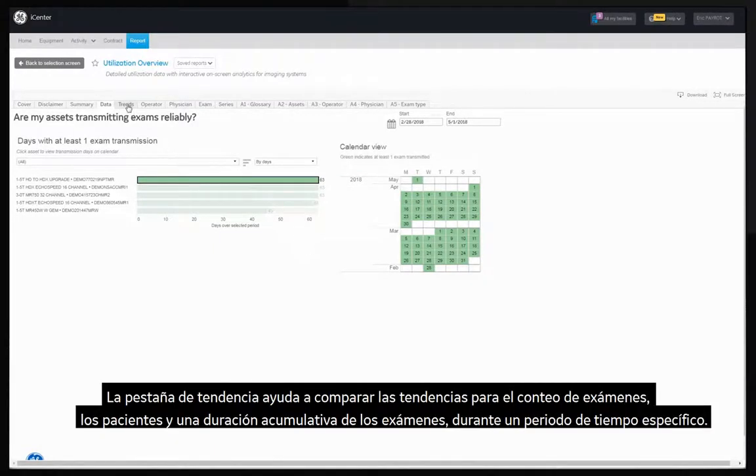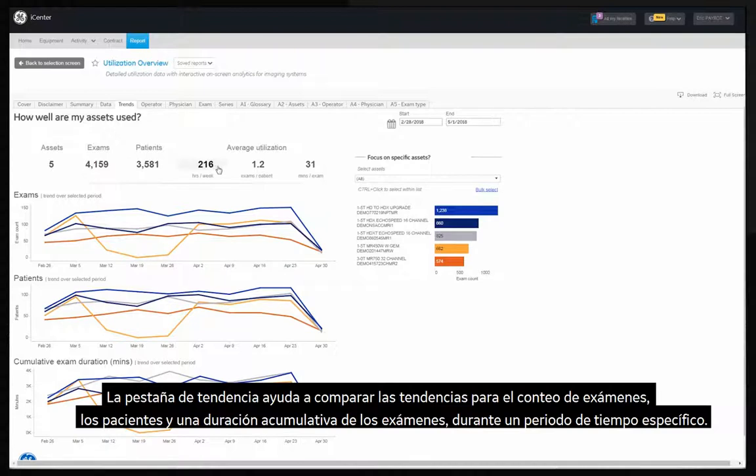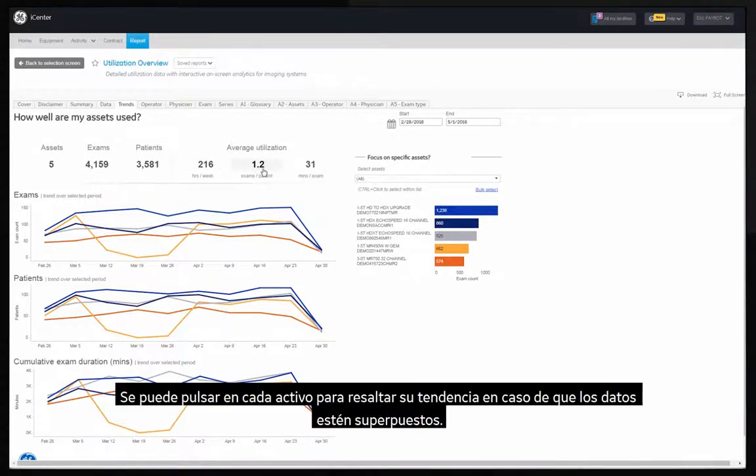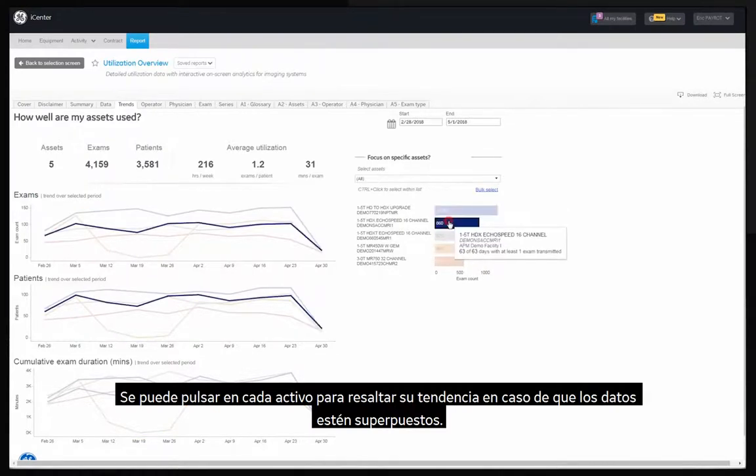The trends tab helps compare trends for the count of exams, patients and cumulative exam duration over a selected time period. You can click on each asset to highlight its trend in case the data points are superimposed on each other.